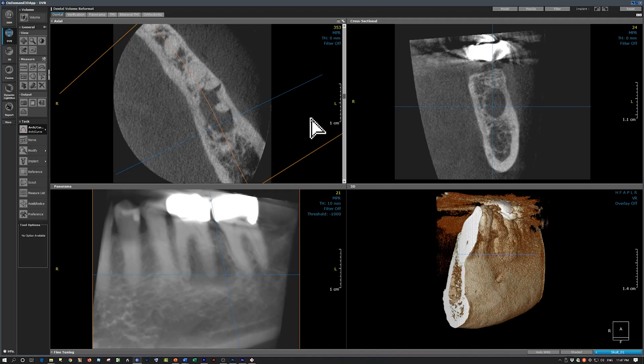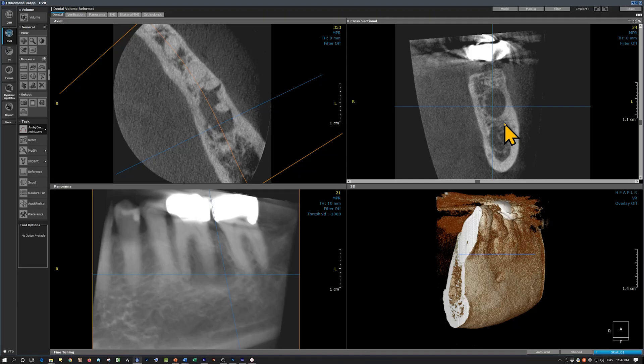So, what is this lesion? From these images, we can conclude that this is not a radicular cyst. This is a linear radiolucency — sort of a pipe or a tunnel. And we can conclude that this is an odontogenic keratocyst.